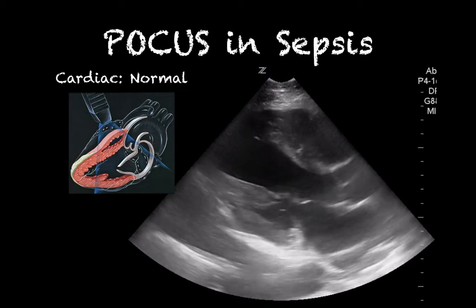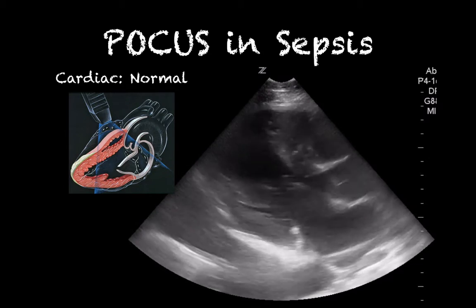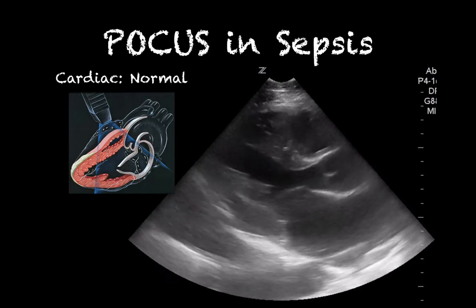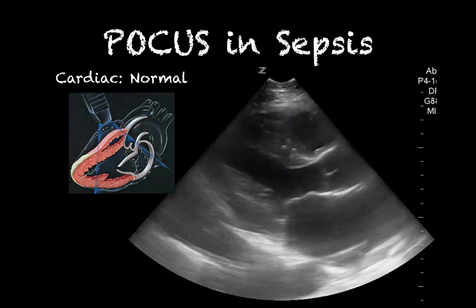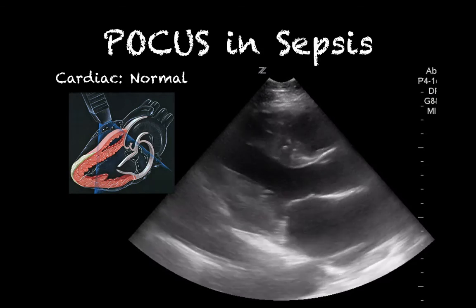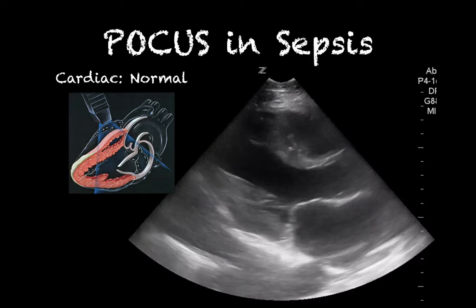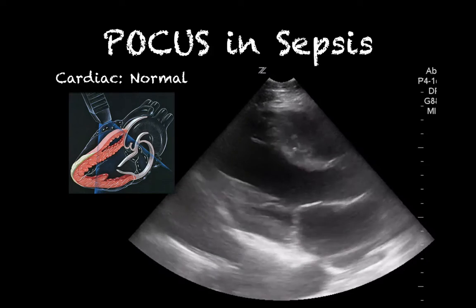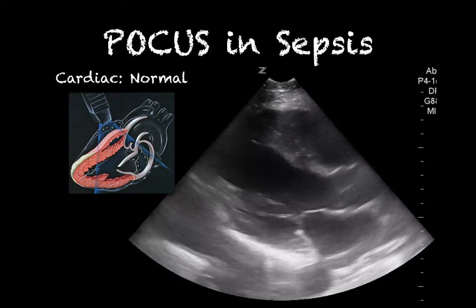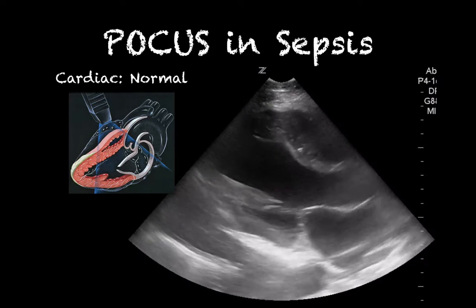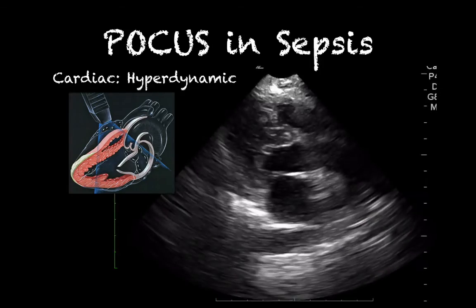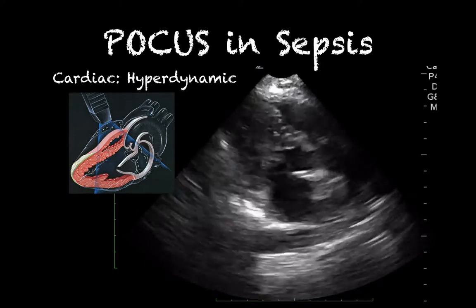Let's talk about point-of-care ultrasound (POCUS) in sepsis. Sepsis affects cardiac function, and we can use ultrasound to quickly identify some of these changes. Here we see a normal heart in the parasternal long view — it has a normal rate, the mitral valve opens and slaps the septum indicating a good left ventricular ejection fraction, and you can see the ventricles contract during systole. The left ventricular walls don't touch.